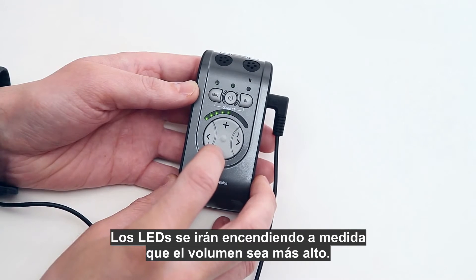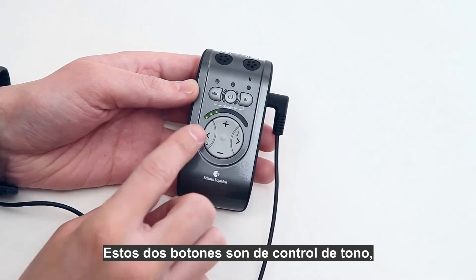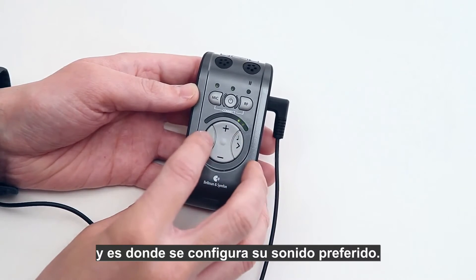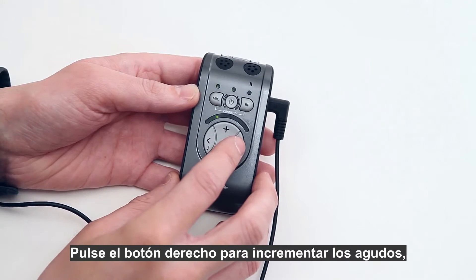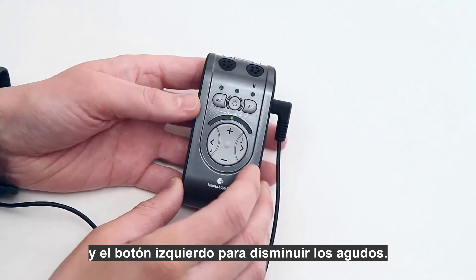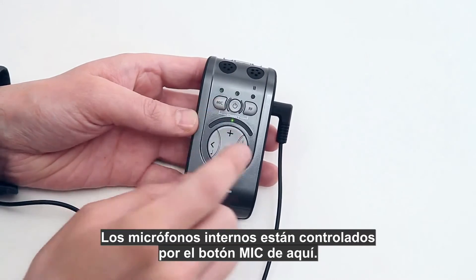The more LEDs that are lit, the higher the volume. These two buttons are the tone controls, where you set your preferred sound. Press the right button to increase treble and press the left button to decrease the treble.